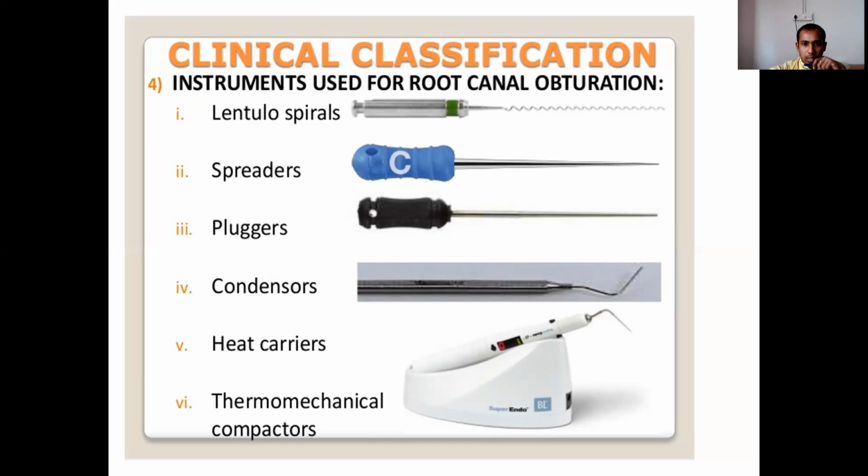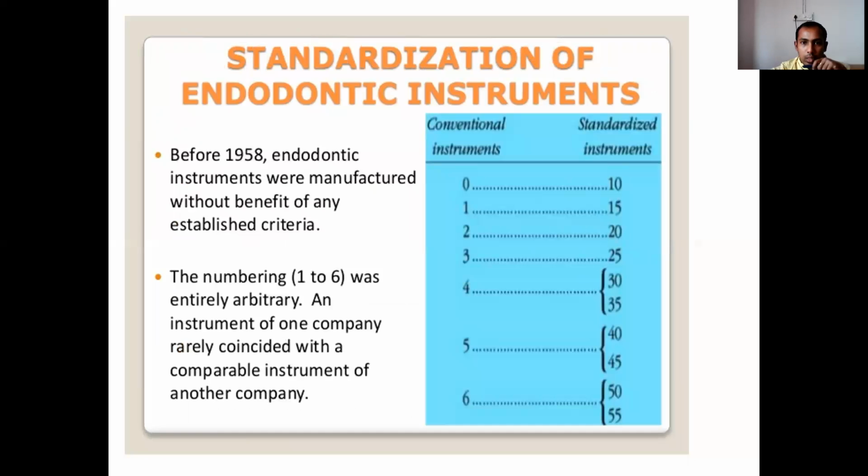In the last diagram, the heat carriers and thermomechanical compactors are mainly used for advanced obturation techniques. These thermomechanical compactors and heat carriers will be discussed in the obturation lab. I think the further slides, the standardization, everything will be discussed in the next class.